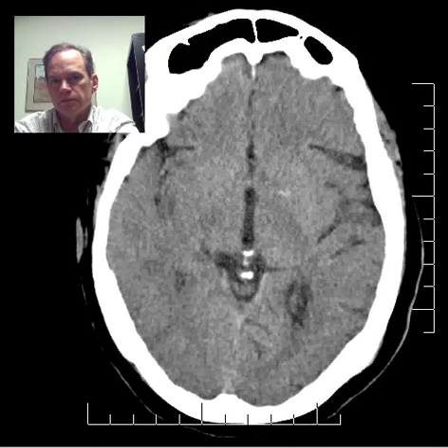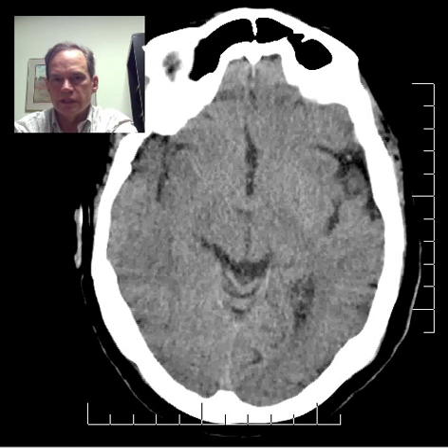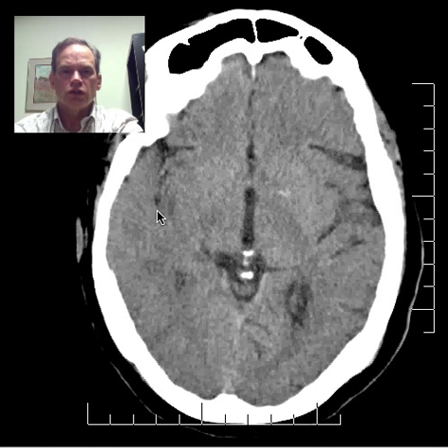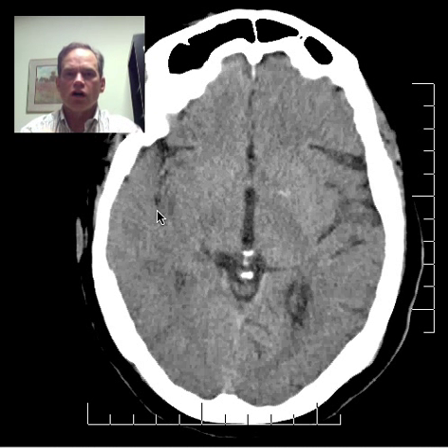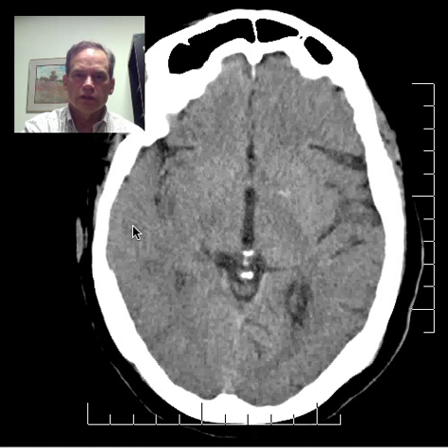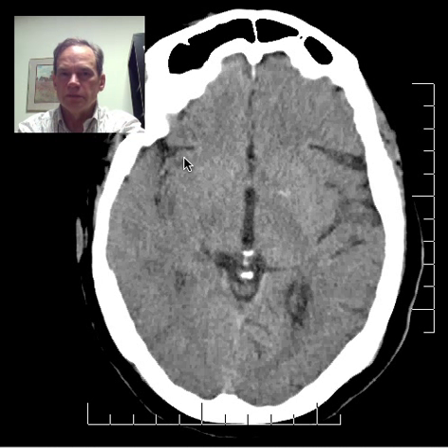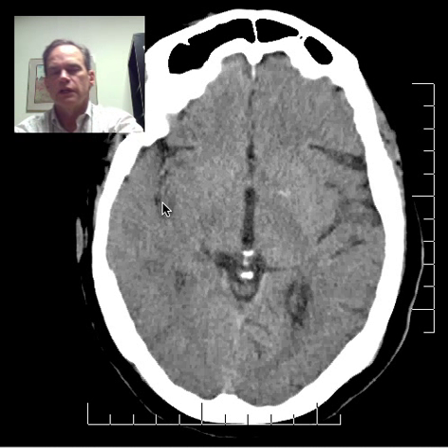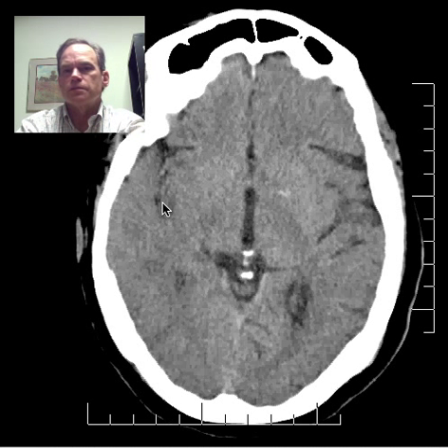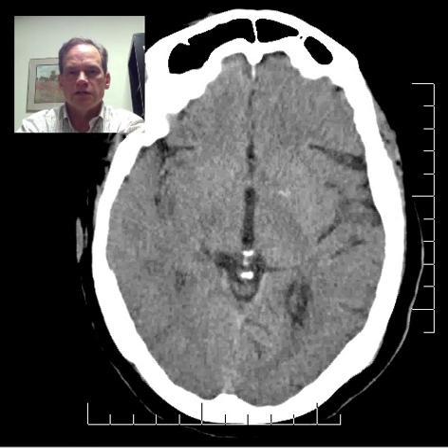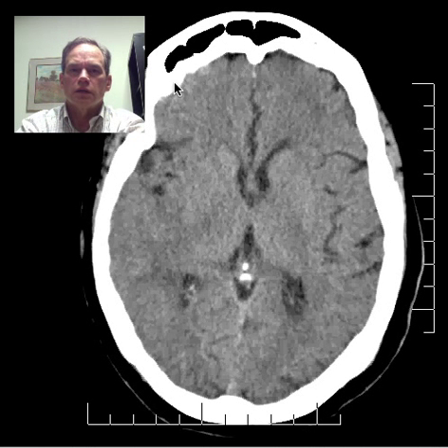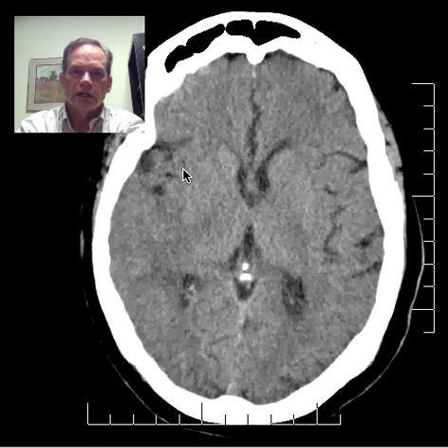The main point is that you've seen the early signs of an infarct: sulcal effacement — loss of the little spaces normally seen between cortical folds — which are lost here, with only the sylvian fissure remaining not fully effaced. The other sign is overall low attenuation, which can be accentuated with windowing on a computer in a teleradiology or PACS setting.